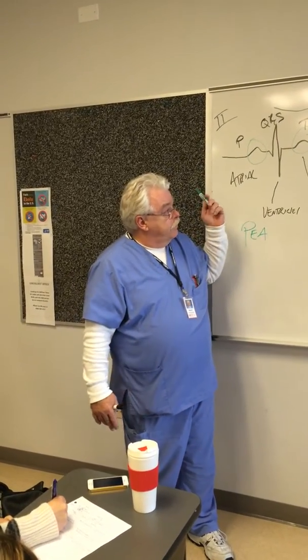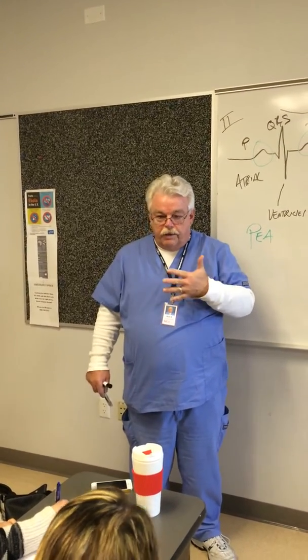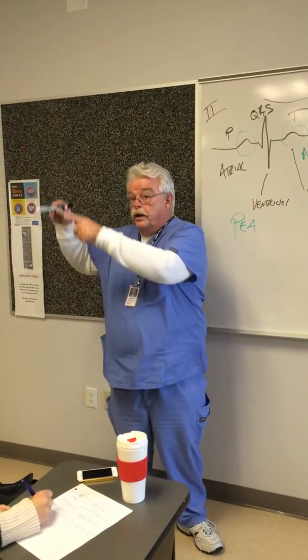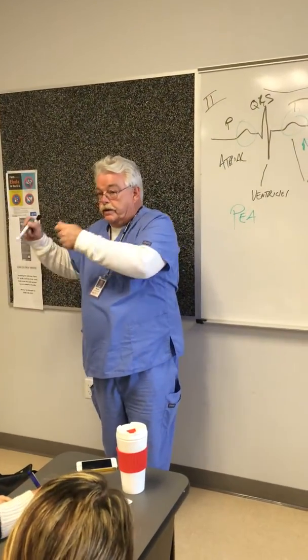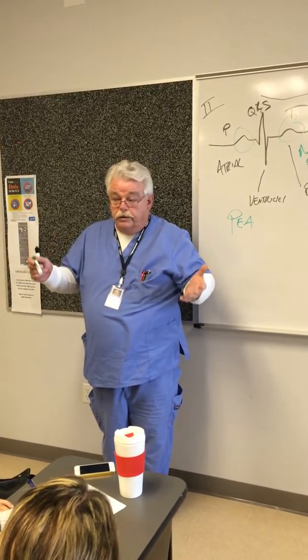The first question you ask when you're looking at any rhythm is, is it regular? There are 5 questions you ask. The first question is, is it regular? You can just take a piece of paper, make 2 marks, and march them out. Do the peaks of the R waves and just march them out. Is it regular? I use calipers. You guys want to borrow calipers? I have some extras, but it's easier just with a piece of paper.